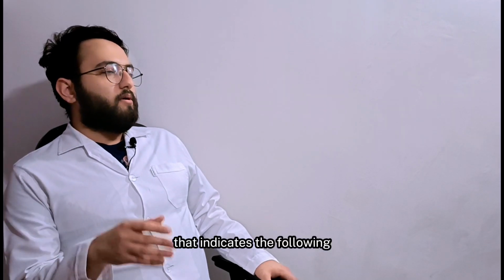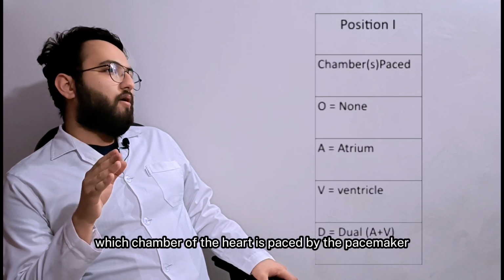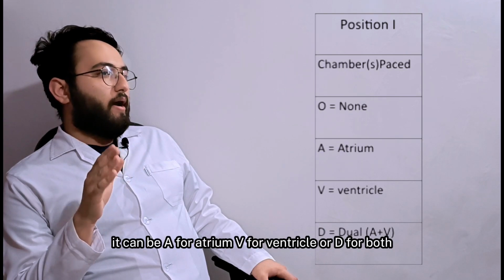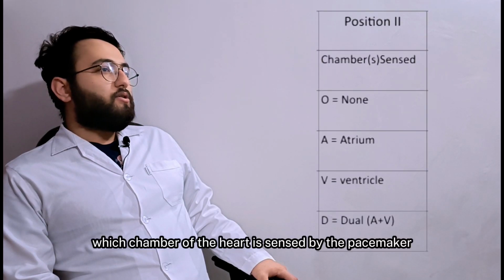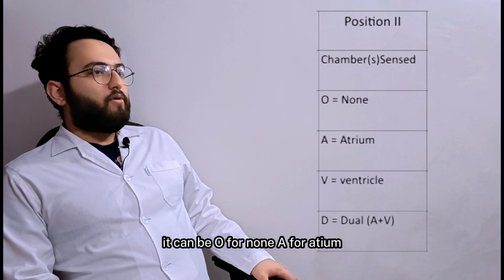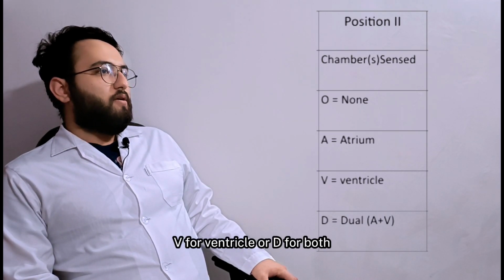That indicates the following. The first letter tells us which chamber of the heart is paced by the pacemaker. It can be A for atrium, V for ventricle, or D for both. The second letter tells us which chamber of the heart is sensed by the pacemaker. It can be O for none, A for atrium, V for ventricle, or D for both.